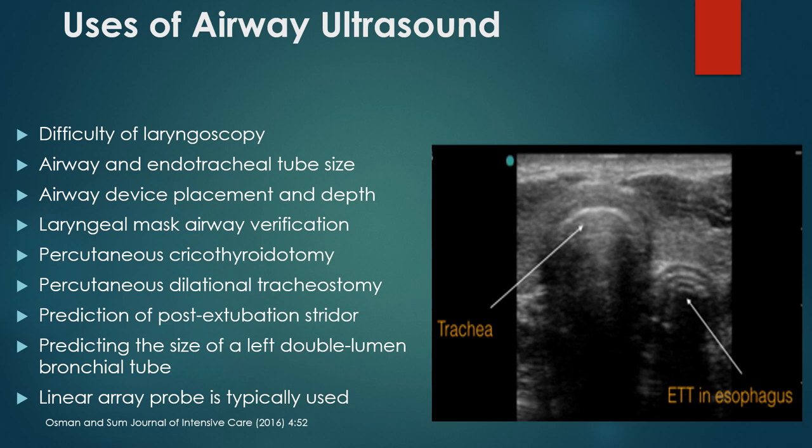Laryngeal mask airway verification. I'm not real sure I've got a big stock in this as far as slowing me down and interrupting the process of flow. But again, it's something that you get your head around it. It may be something that you find a good bit of utility for.